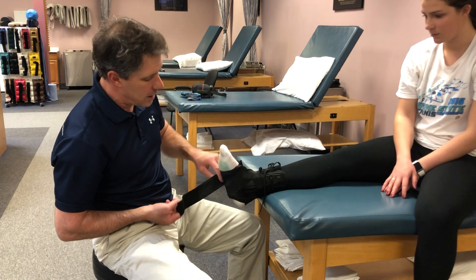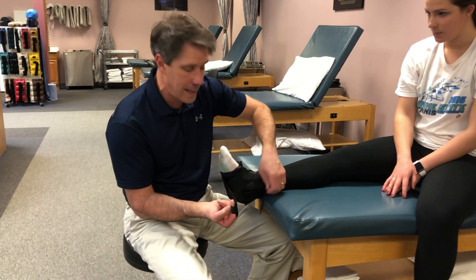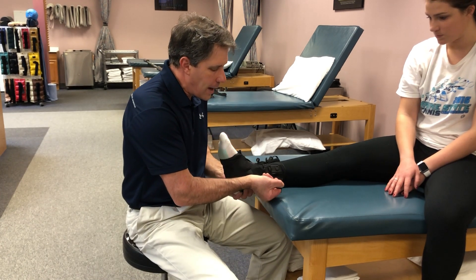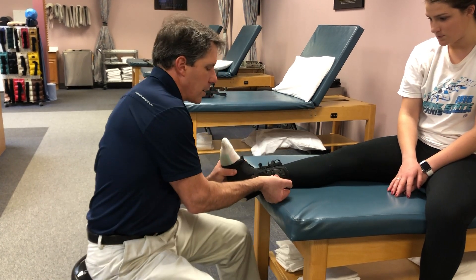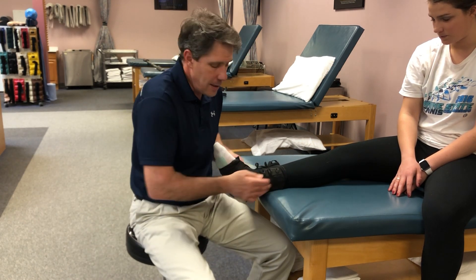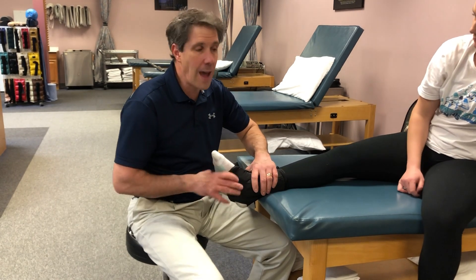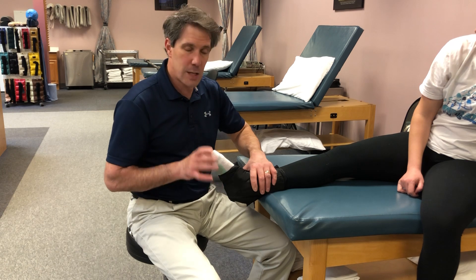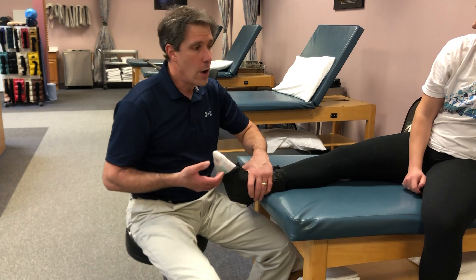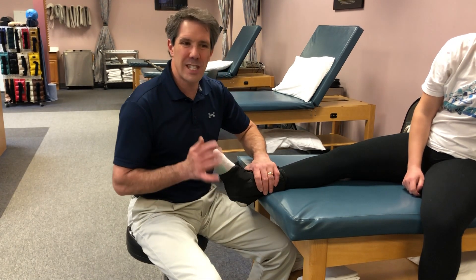This is the most important part, especially with the inside strap. What I want to do is simulate what that posterior tibial tendon does on the inside. I start where it attaches and pull the foot upward and inward a little bit like this, then attach that strap so it gives nice support. It's amazing — you don't typically use this type of brace for this problem, but I have very good success with it, especially early on when we want to keep the patient active, or maybe they need to work or go to school and be on their feet.